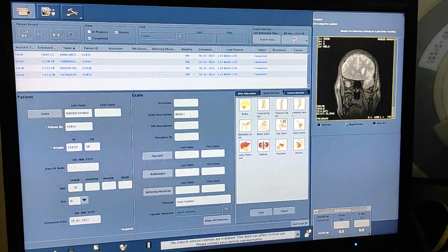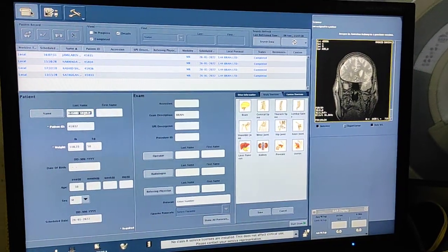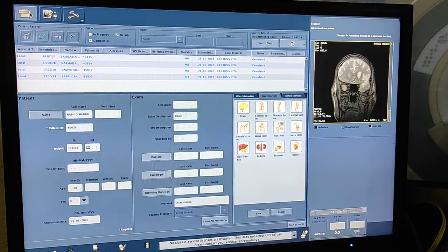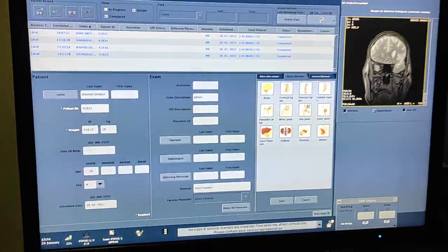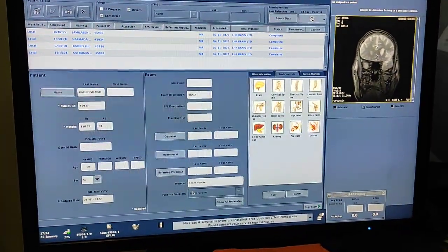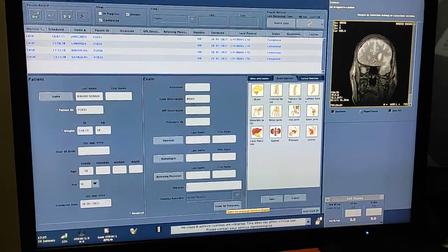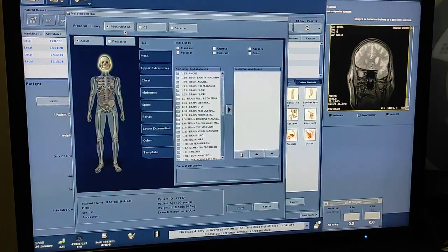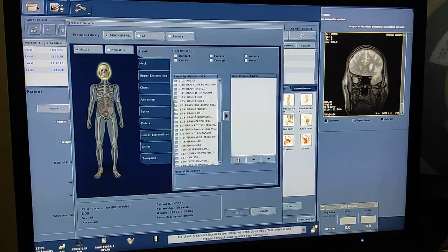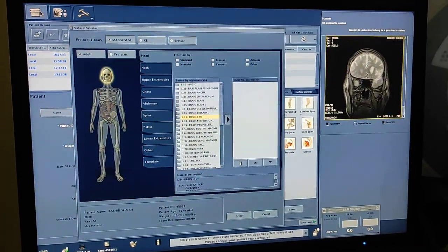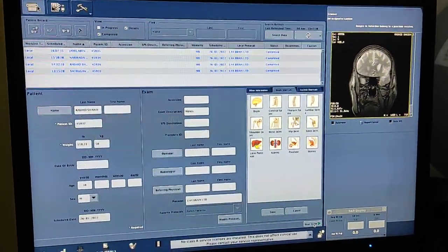So let's start. We are on the entry desk. First of all you have to fill up the data: patient name, patient ID, weight, age, sex. In exam description you have to write down 'brain'. From here you have to select 'show all protocols', select the protocol from here. I will click on the protocol — click on brain/neck/upper. I have kept the protocol in 'head'. Click whichever protocol you want, then enter, accept, and start exam.